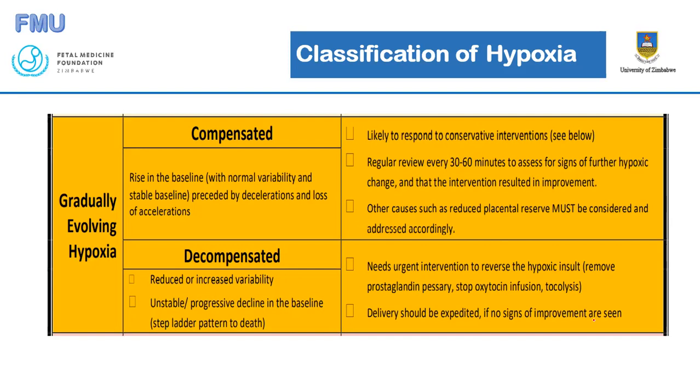But coming to your question of mobilization, while mobilization is generally encouraged and advocated for women in labor, high-risk women will benefit more from having their baby monitored rather than moving around. The women who are really high risk, people with abnormal Dopplers, fetal growth restriction babies, or people who are having antepartum hemorrhage, will benefit more from having their babies monitored than from mobilizing. And besides, our labor wards are not mobilizing labor wards. I don't know, colleagues on this platform, how many women have you seen mobilizing in our corridors while in labor? Most of them are actually lying on their bed. So in our situation, I do not see this being a big problem, to be honest.